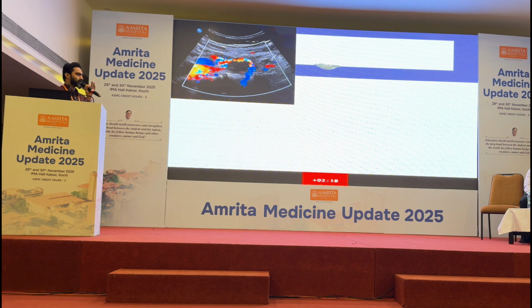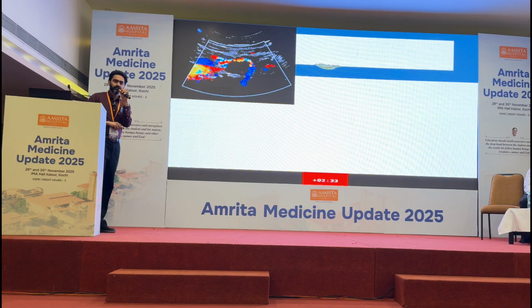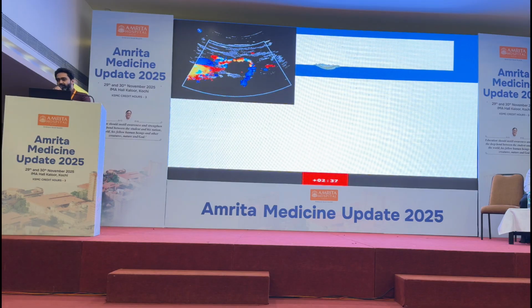That's a nulliparous patient, around 35 years old, trying to conceive, who came with missing periods. But ultrasound did not show any gestational sac in her uterine cavity, though her beta HCG was around 28,000. So then we did the ultrasound.